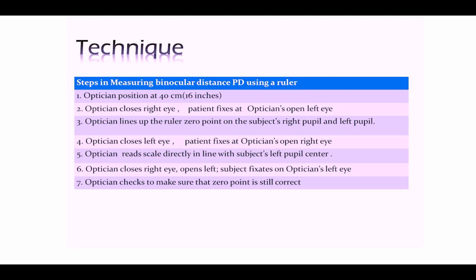All right. Then let the patient see your left eye and use the ruler to point exactly at the right pupil of the patient. Start the right pupil with the 0 point and then measure exactly the distance until the left pupil. So from 0 till the other pupil, you will find about 60 to 70 or even 75 millimeters of distance.